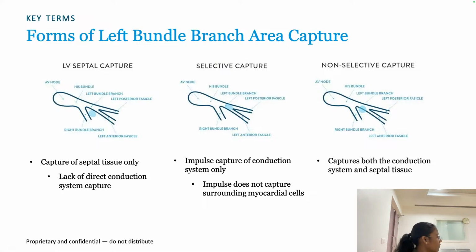For example, if we have a 120 QRS, the shorter part will be the LV. We can split the QRS into two parts. The first activation will be the LV, so we can measure from the pacing spike to the peak of the QRS. If it is around 60, then the remaining part will be the RV.